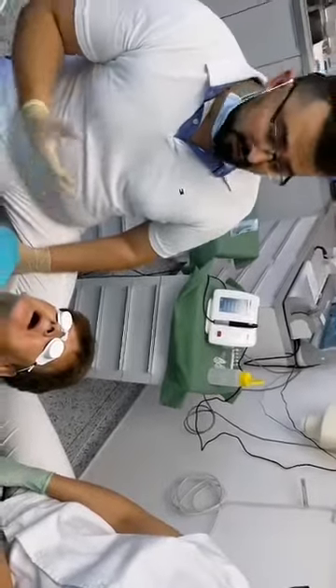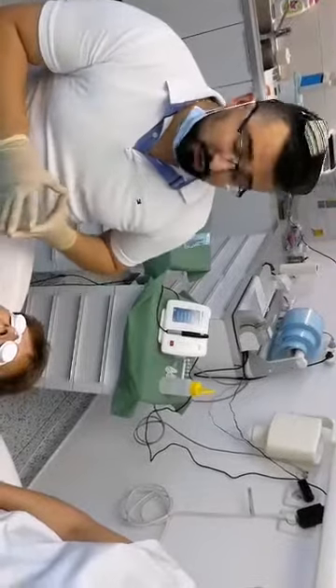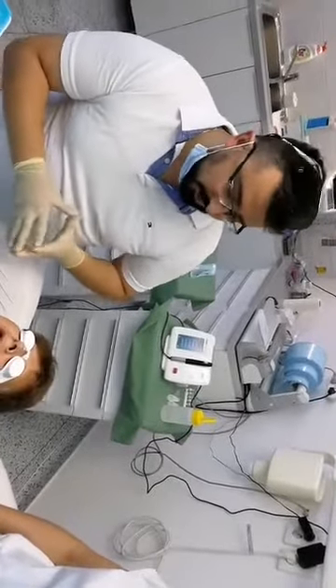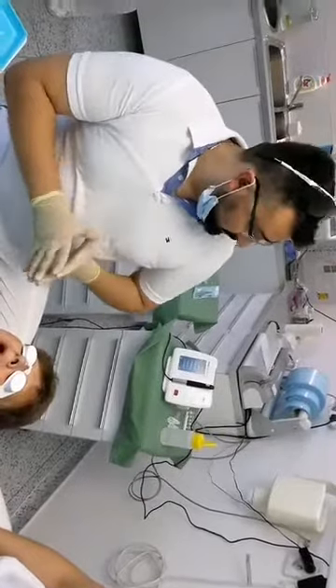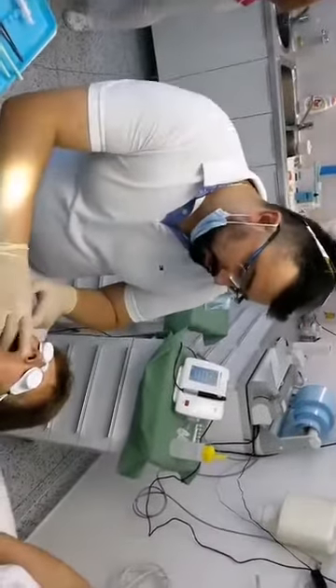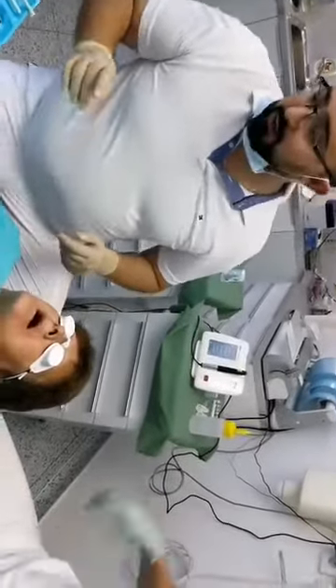And because there is also a carbonized layer of the tissue, there is usually no trouble with secondary infection. It's already anesthetized, so we can proceed directly to the surgery.